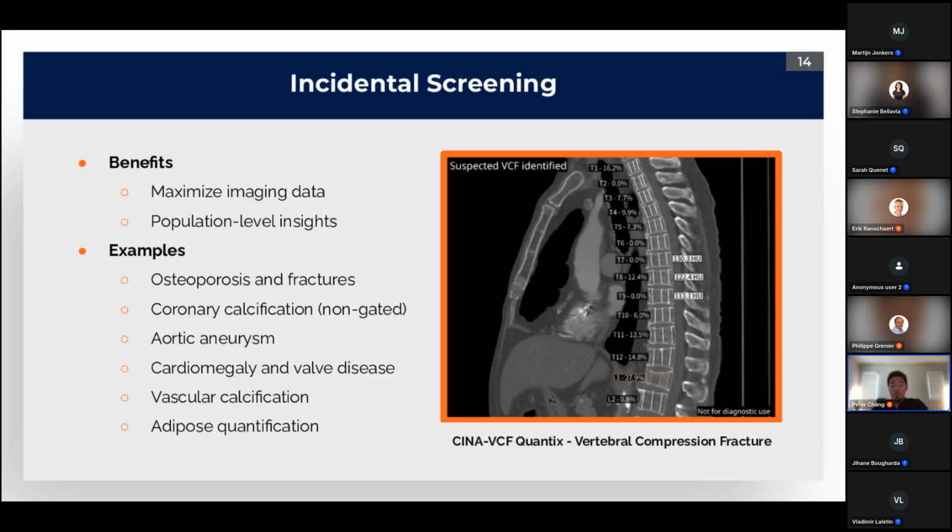You did a simple measurement here at certain vertebral body levels and correlated that value to known DEXA scan outputs. And once that relationship had been solidified, we could then start using these routine CT exams to do that exact same type of screening that we used to have to order an entire different study for.